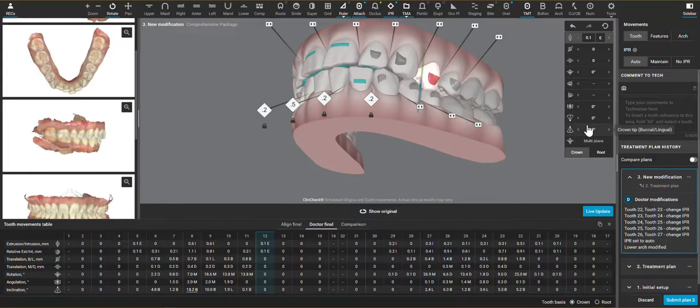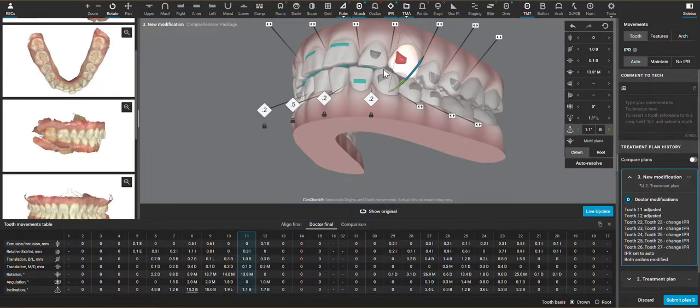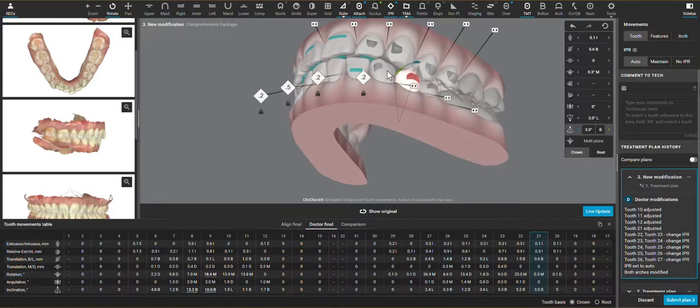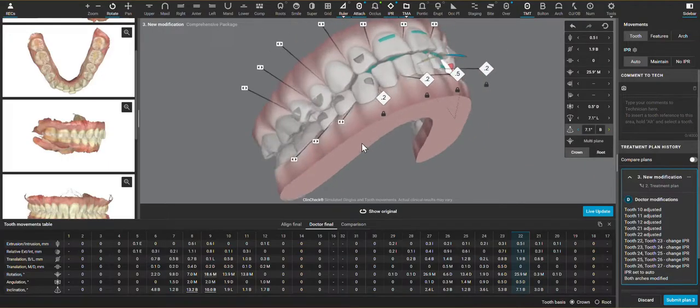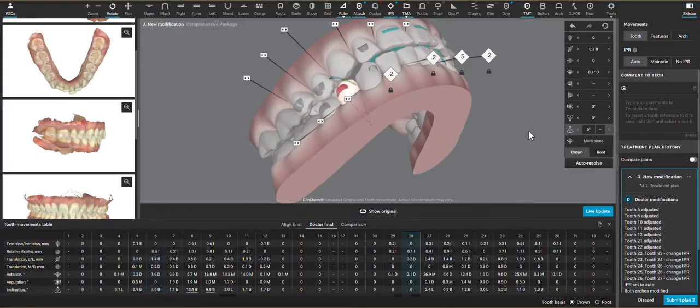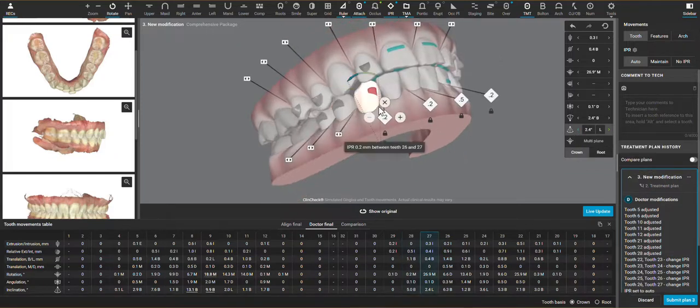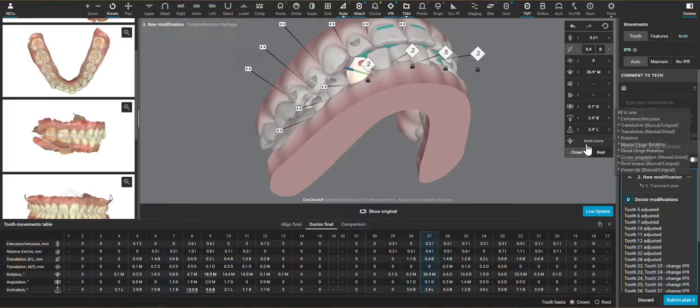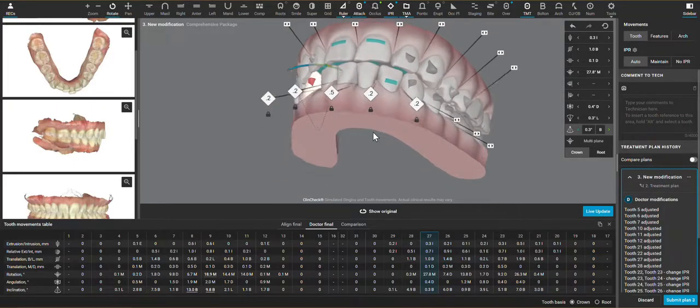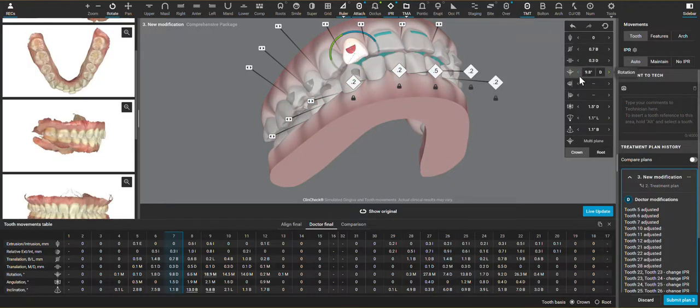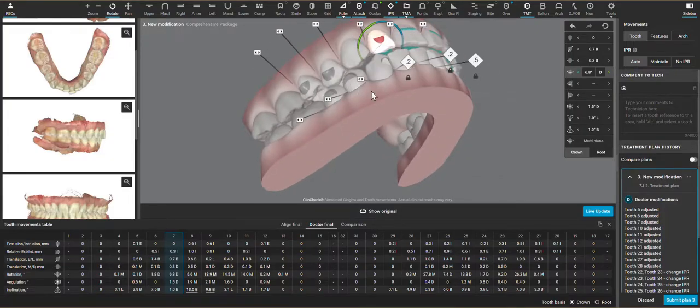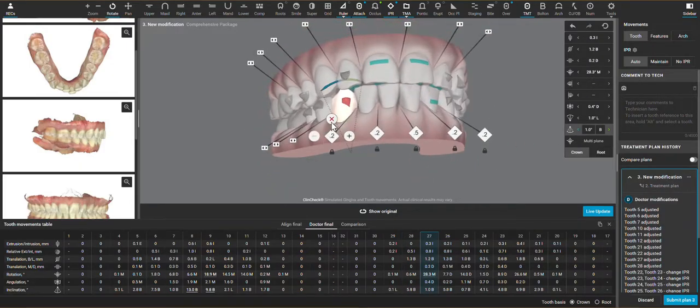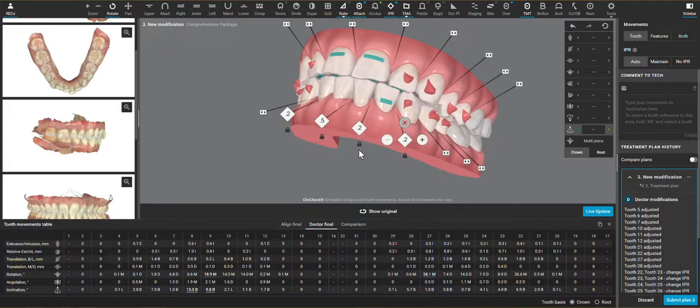If I can do more expansion of the premolars and do a little bit more tipping, which I like to do with the 3D controls, then sometimes that can reduce our IPR numbers to practically no IPR for the case. So the type of movement that I'm mostly focusing on is crown tipping, which is the easiest movement for the aligners to do. Generally puts the teeth in a more upright position, helps the overjet, and my goal with this is to see if these types of movements can help keep the amount of overjet that we're looking for without doing as many sites of IPR.